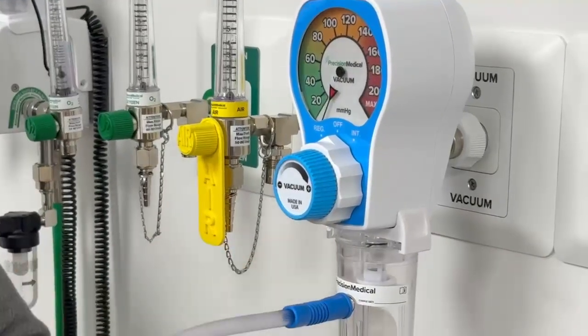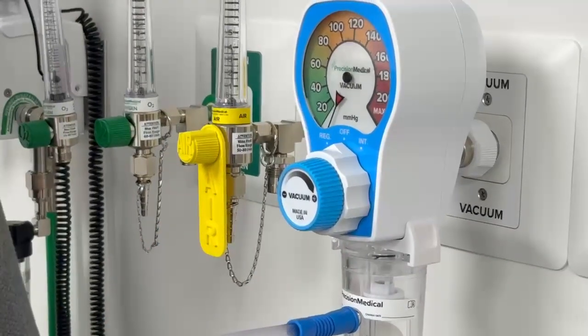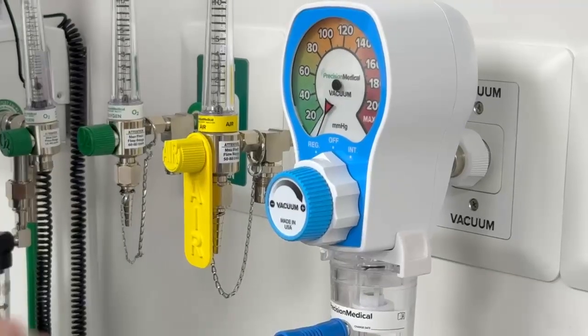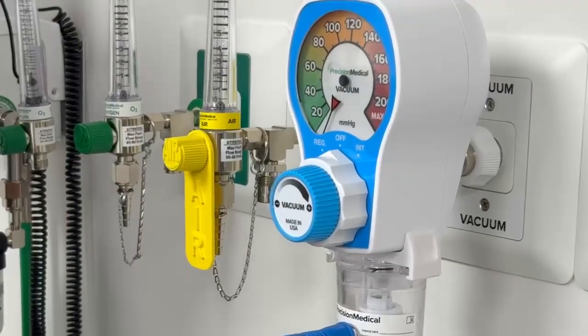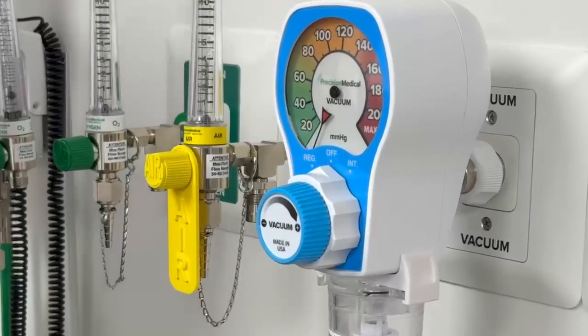From the safety features, we have a green float ball inside. This float ball positively shows flow — it only takes about three liters a minute of flow for this ball to be visible. So as long as the system is patent, you will be able to see this ball flow.